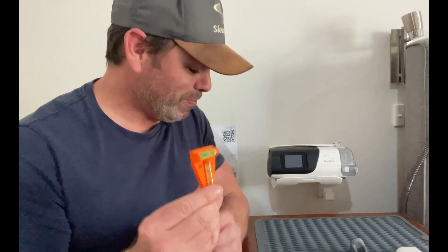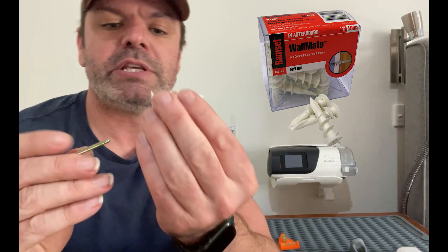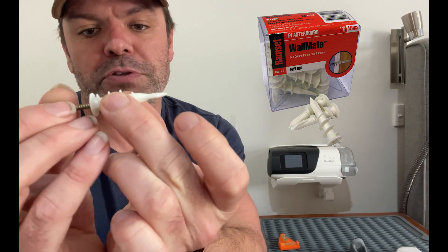A little level, these plasterboard anchor screws. Now these ones here are rated for 10 kilo and you could probably get away with the 5 kilo ones. I just went for the 10 kilo just to be sure. And then they also come with these little screws that screw inside.